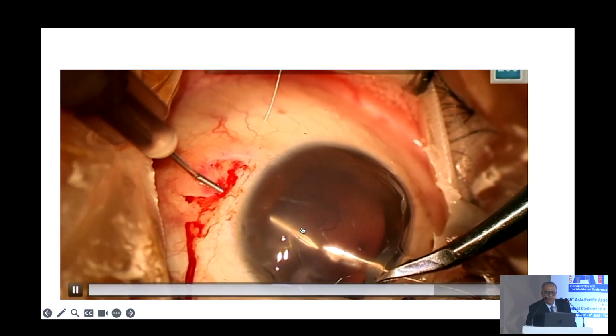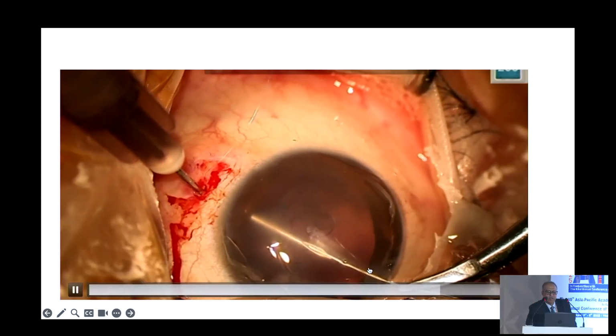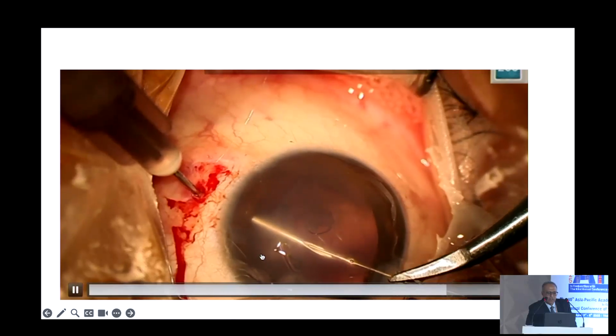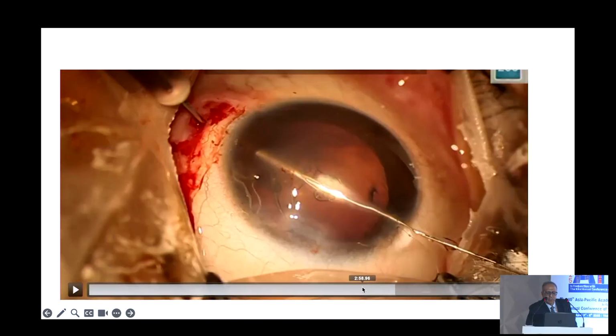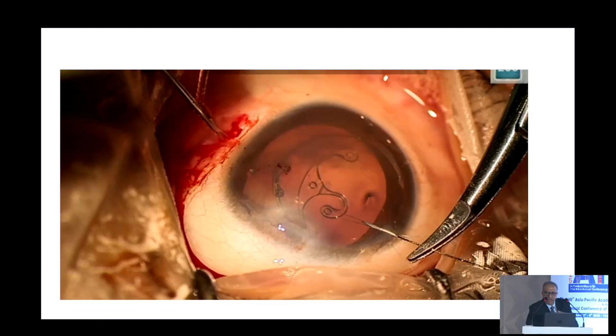This is unedited because I want you to see how, with both your hands, you're able to do it, and see how closely I am holding. For better control, I would like you to see how close I am holding it. So when you hold it close, you have better control. Dr. Chi, would you like to add something?